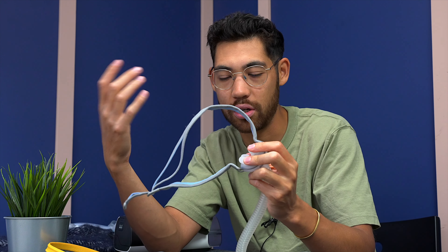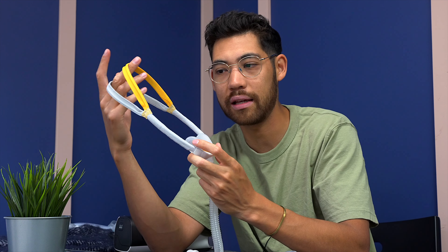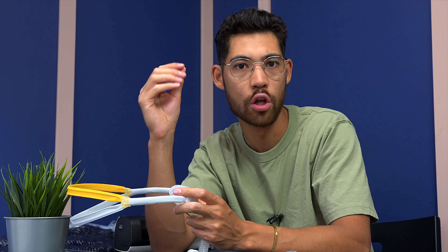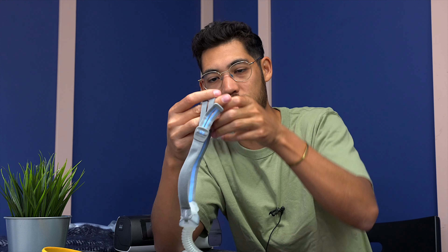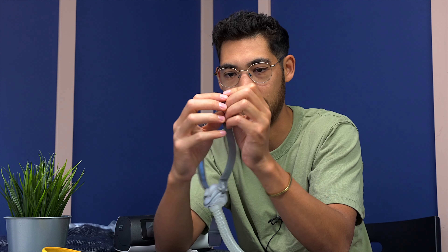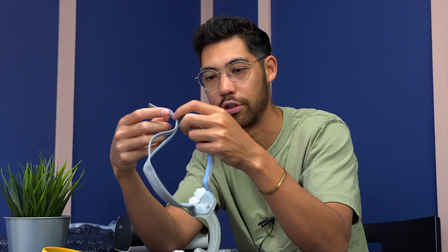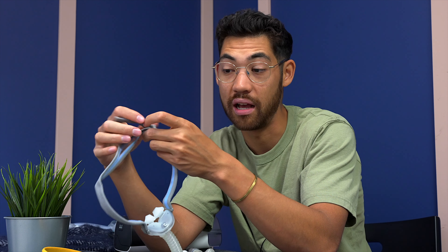Then we have the P10's tried-and-true elastic. It goes out and there's tension — by its very nature it goes back in. There's a little bit of plastic on the sides that arc up around and above the ear. The Solo doesn't have that, but unlike some other Fisher & Paykel masks, I don't find any irritation at the ear whatsoever. So both masks don't touch the ear and are both extremely comfortable on the face. The back just splays out elastically with no extra reinforcement, and there's one strap you can tighten or loosen as it wears out over time.